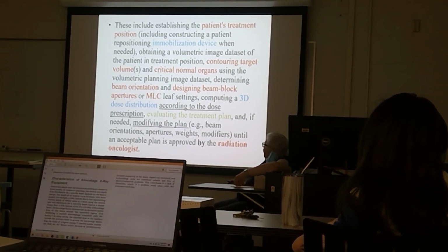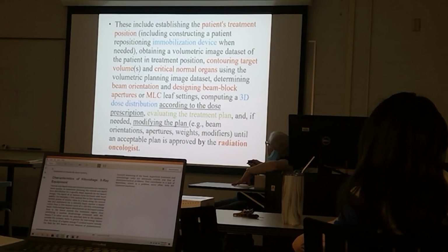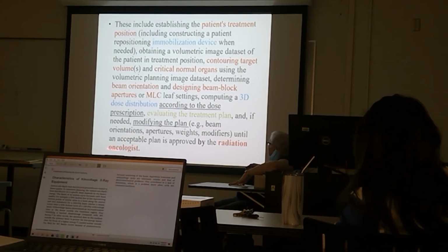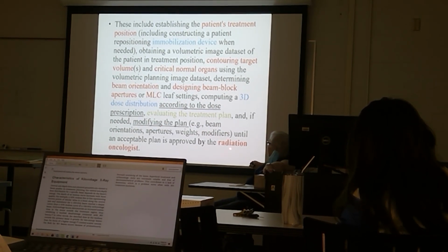And modifiers, that would be wedges or bolus or whatever you need to do. And so this can all get changed until the radiation oncologist is satisfied.